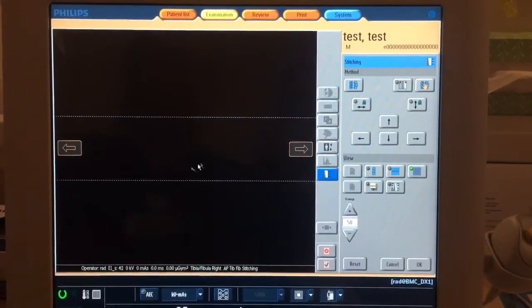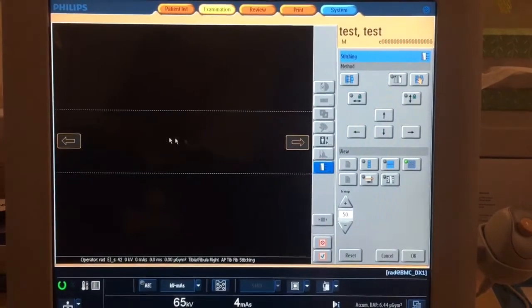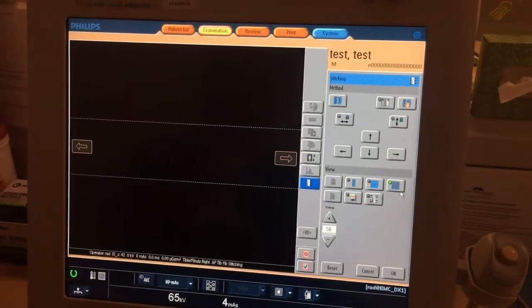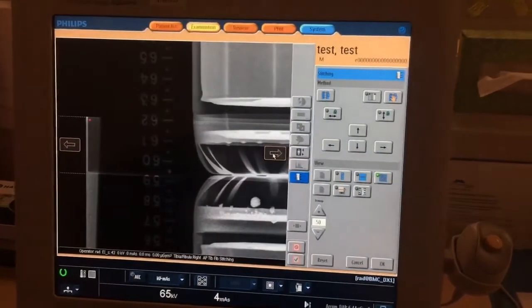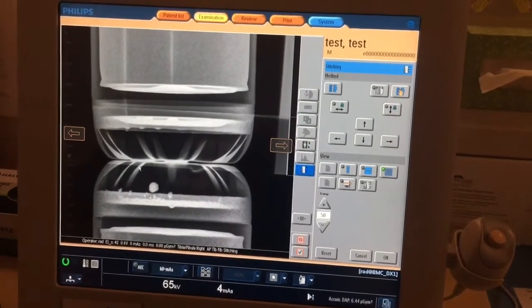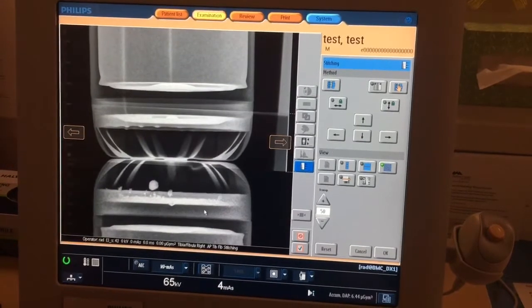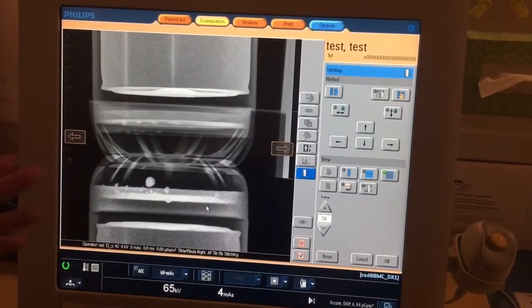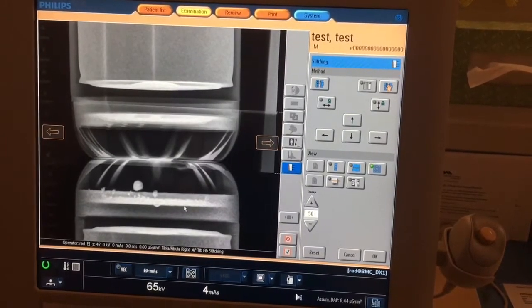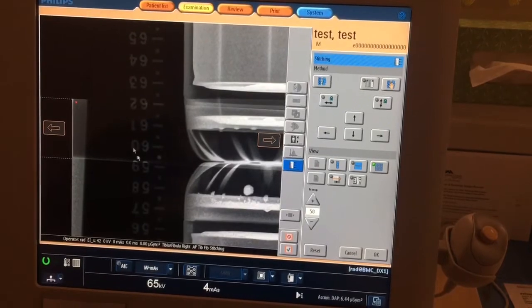Make sure that when you are going to slide over to find your anatomy that you aren't dragging, because that will drag your anatomy and misalign it. So now that I'm zoomed in, I'm going to slide over so I can look at my anatomy. Here shows a really great image of where my anatomy lines up. It looks like the computer stitched it perfectly for me. However, if my image came out like this, that is when I would need to slide my anatomy around and line it up properly. What I can also use is my ruler.